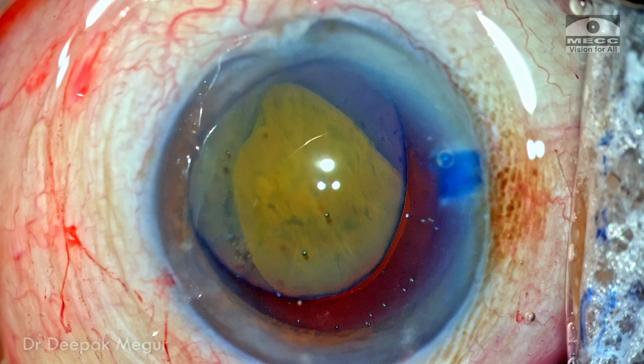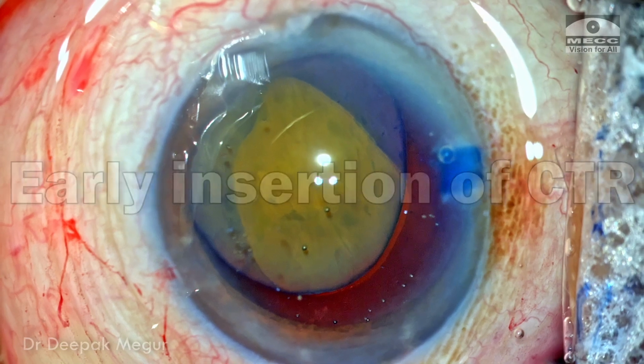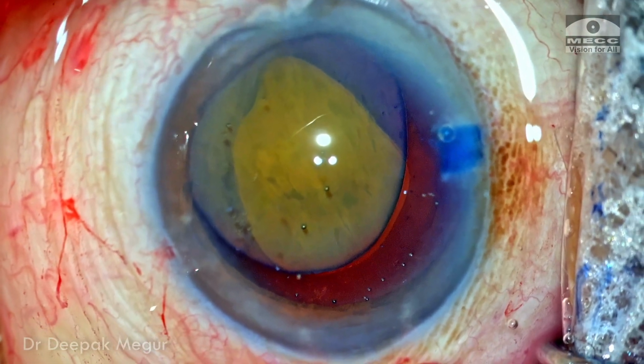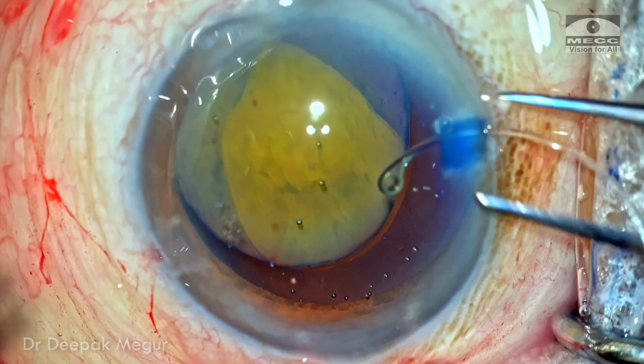During the time of nucleus management, the bag with its loose zonules in this quadrant can be floppy and I can lose the bag. So timely intervention by introducing the CTR was a key step. The bag is already inflated with sodium hyaluronate. There is enough space so that the CTR can be safely inserted in the capsular bag.